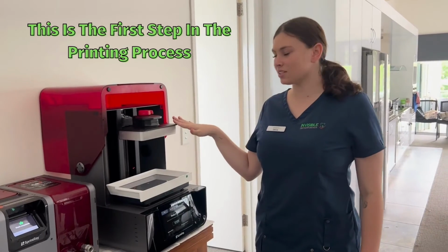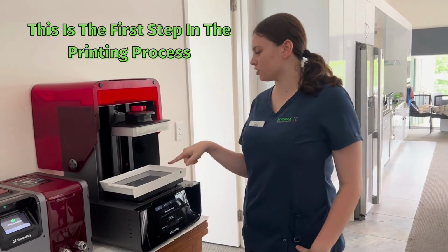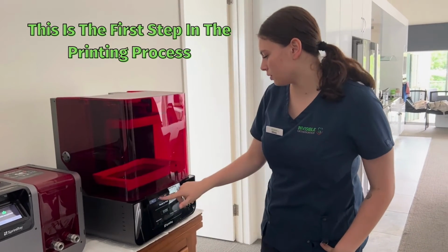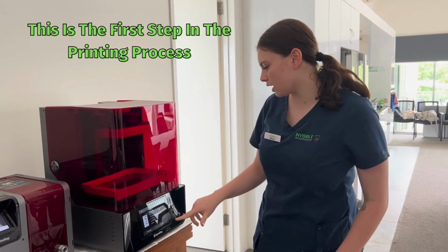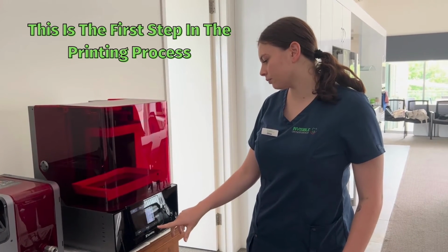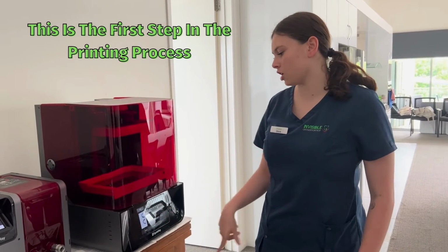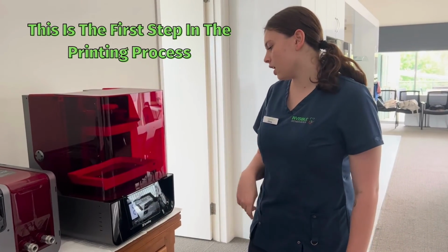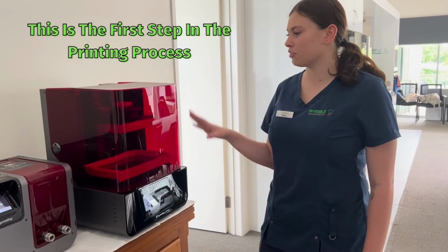Alright, so this is the printer that we print the models on, and we just use grey resin here. We've got some in the queue, so we just pick the name and press print, start print, and it'll tell us how much time. This normally takes about 35 minutes, and we're just printing 2. And then it also tells us how far we need to fill up the resin.